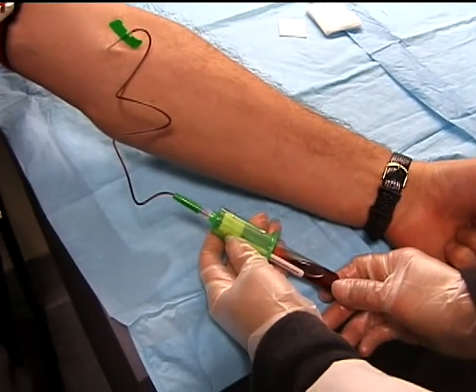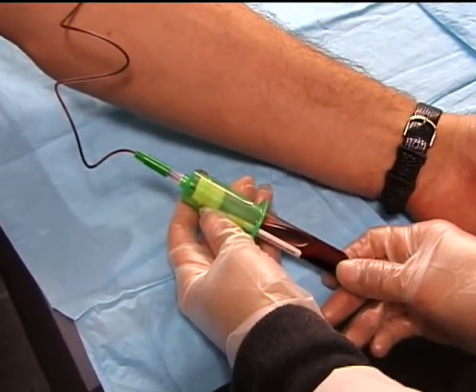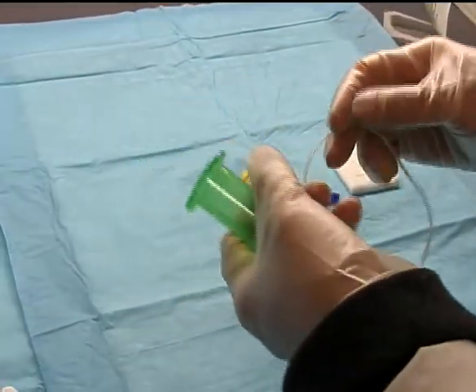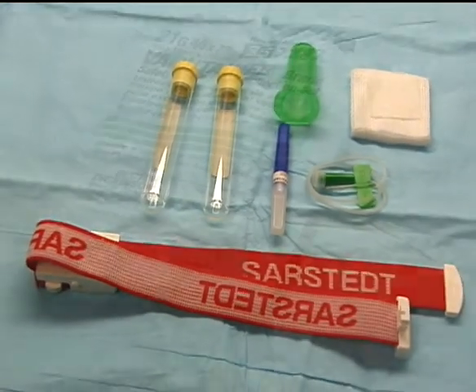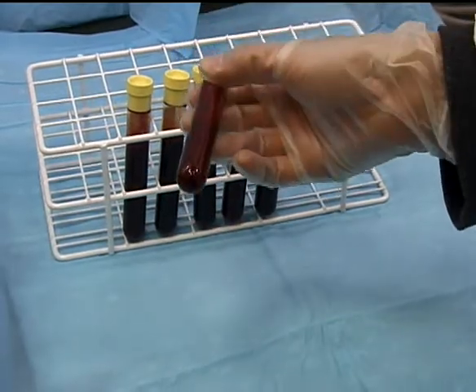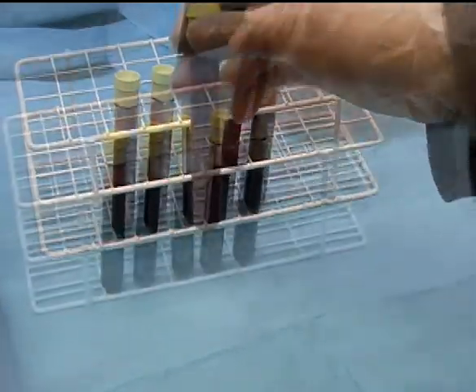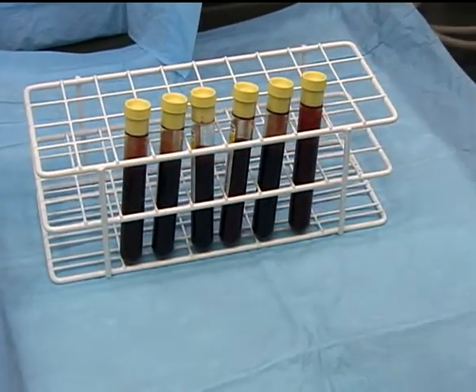Prior to the start of the procedure, blood is drawn from the patient by the use of a butterfly holder and yellow top blood collection tubes containing citrate dextrose anticoagulant. Alternatively, blood can be obtained with a collection needle and holder. Both are provided in the kit. In order to ensure even distribution of the anticoagulant, each blood collection tube is gently inverted at least five times. The tubes are placed in a suitable rack to await placement into the centrifuge.